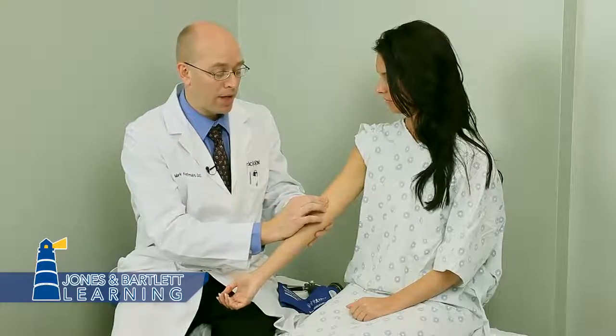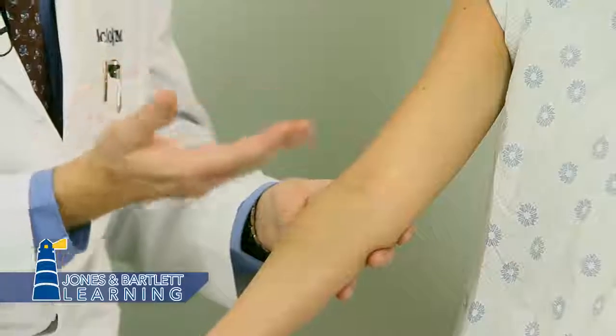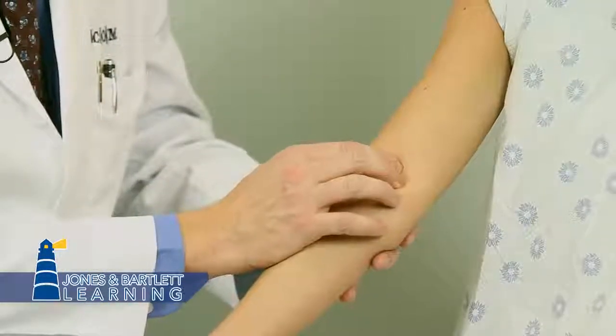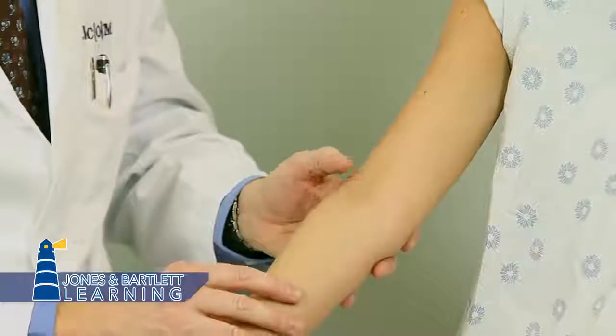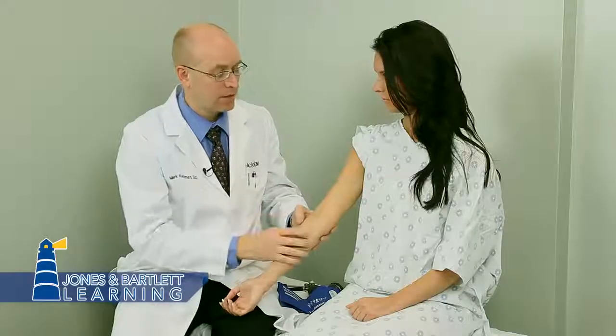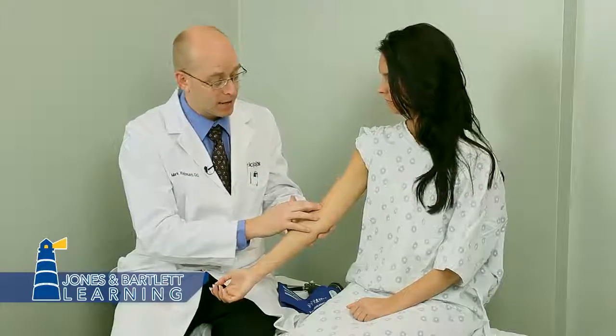A technique to make it pop out, if somebody has a thicker arm, is to hyperextend the arm, which brings that artery closer to the surface. You might be able to find it easier that way. 20% of the time it'll be lateral to the biceps tendon.